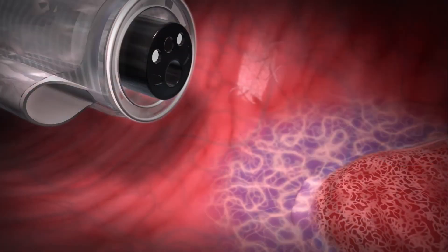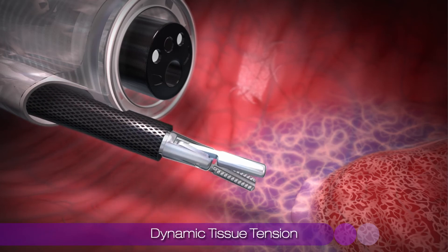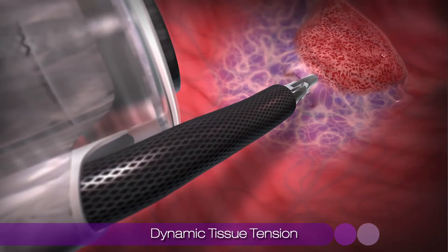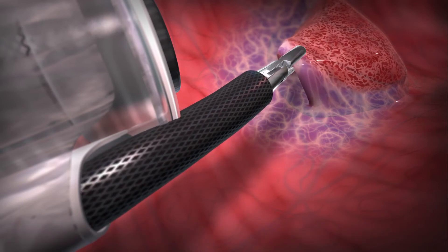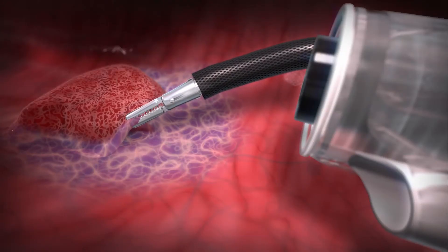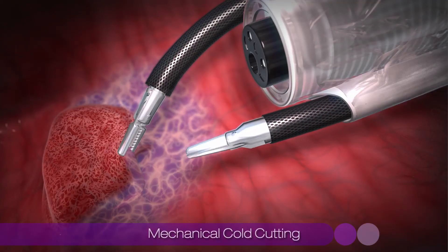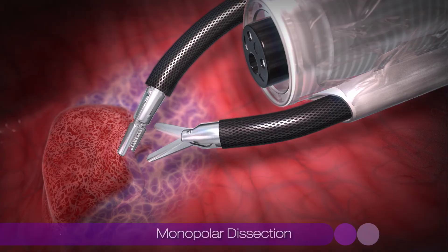The first of these devices, Dilumen IG, provides dynamic tissue tension as it can grasp and re-grasp tissue and retract in multiple directions, which provides improved exposure for controlled dissection. The Dilumen IS can be used for both mechanical cold cutting and monopolar dissection.